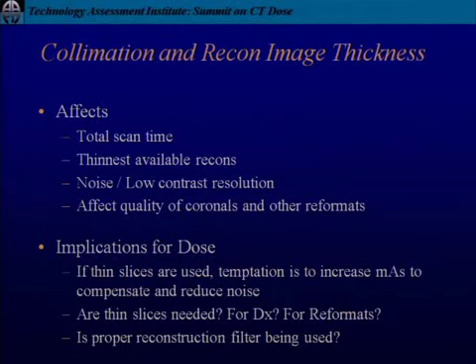And when you look at the scanners that have 128 channels, 256, 320, you have the horrible choice between 0.5 millimeters and 1 millimeter primary scanning thickness. There's not much of a choice. But what you can choose is the viewing thickness, and that's what we're talking about. Thank you for those comments.